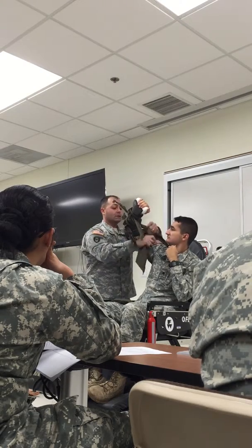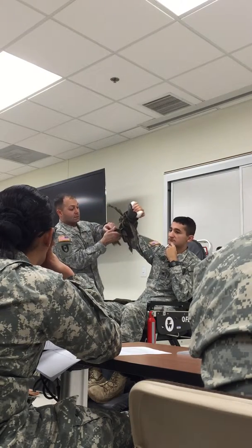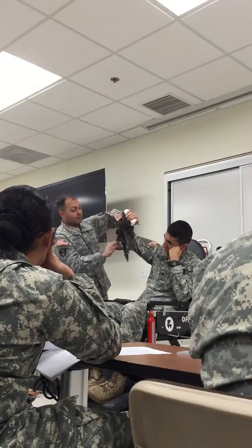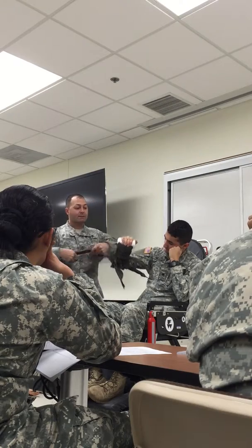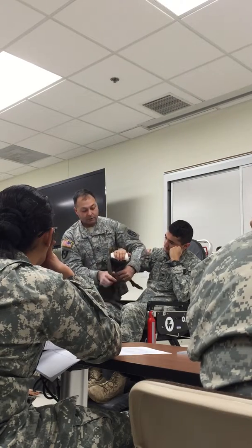So you do that at the position in front of their chest. You said left over right? Left over right, right over left, it doesn't matter. Alright.